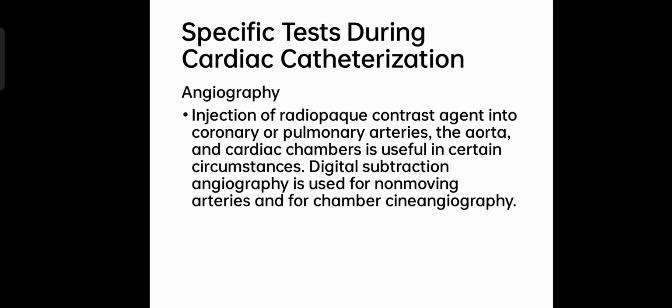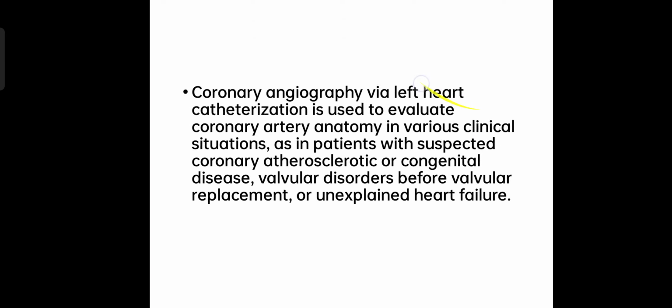Specific tests during cardiac catheterization: angiography, injection of radiopaque contrast agents into the coronary or pulmonary arteries. The aorta and cardiac chambers can also be injected, which is useful in certain circumstances. And digital subtraction angiography is used for non-moving arteries and for chambers.